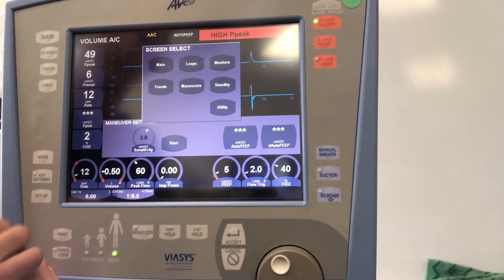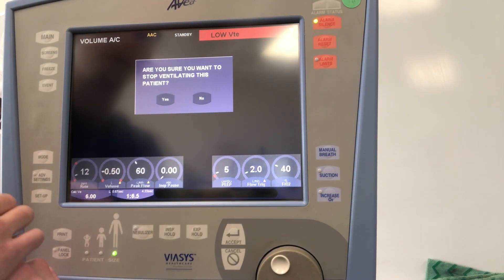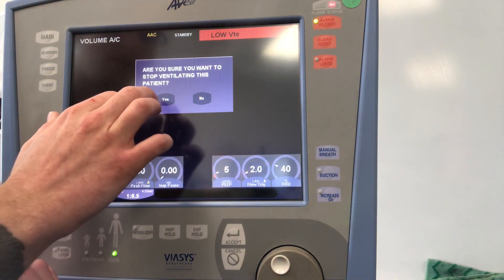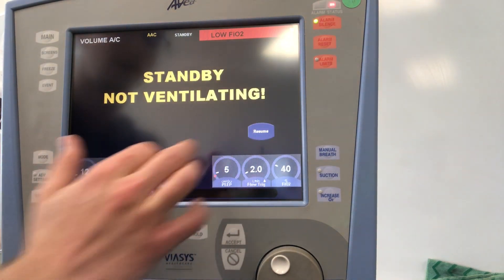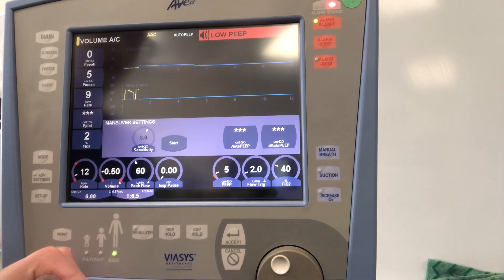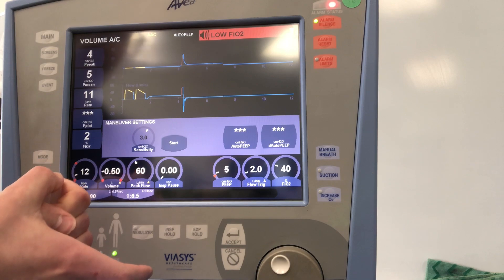The biggest button you'll probably use is your standby button. Go to Screens then Standby — it'll ask if you want to accept. If you say yes, the ventilator goes automatically into standby. Hit resume and it won't give any breaths until it feels resistance, then it'll start ventilating again.